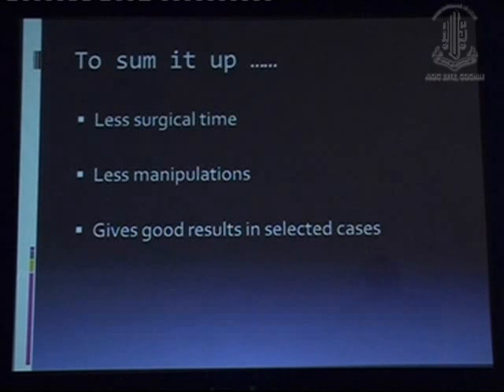To sum it up, why do under oil surgery? They have less surgical time, less manipulation, and really good results in selected cases.